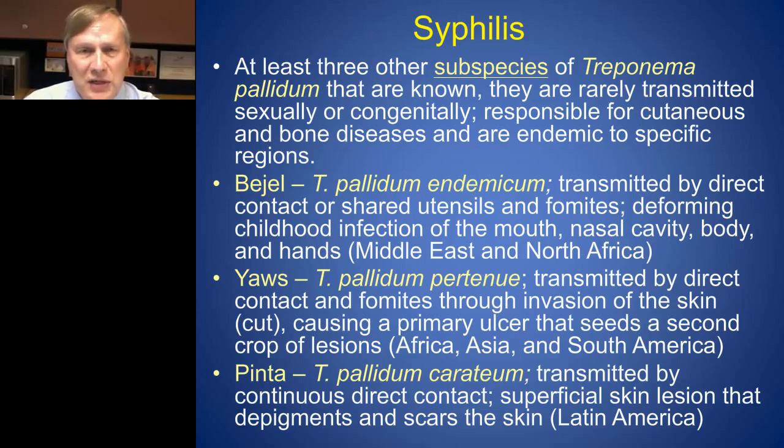There's other things that might potentially cause false positives, and we'll talk about them a little bit later in the presentation. Things like periodontal disease, because we all know the microflora in our mouth contain a lot of spirochetes, and some of those can cross-react too, even in some of the most specific tests that we have for syphilis. So it's just something to keep in mind when we go through talking about the diagnostic tests and the specific tests.